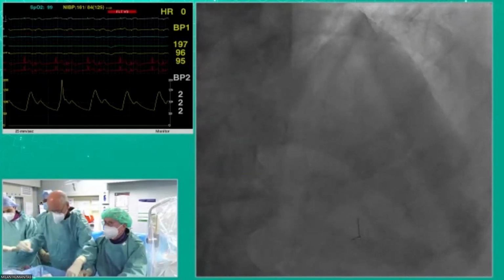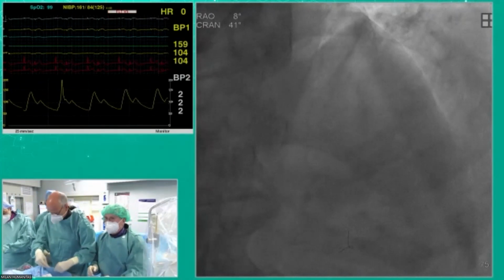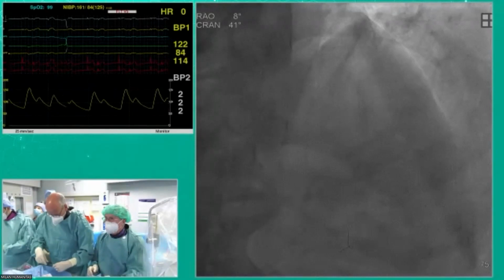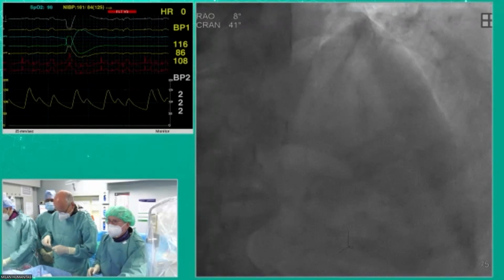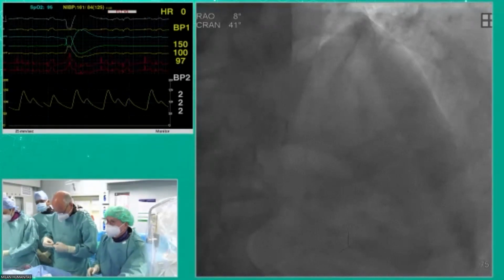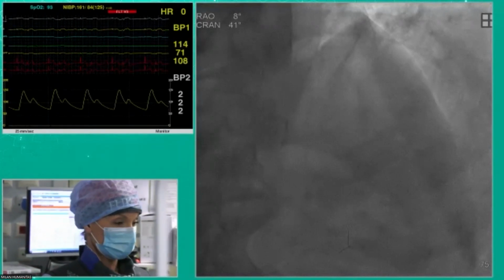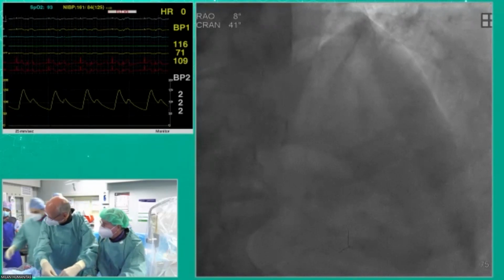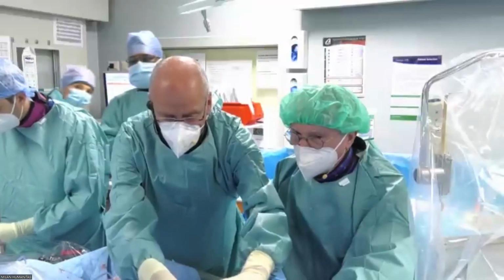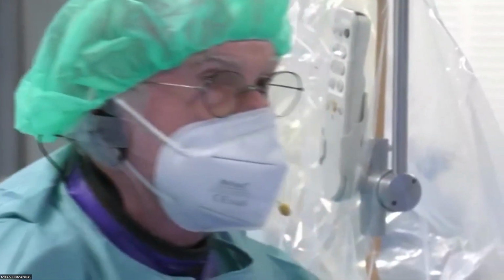I wanted to place a stent proximal, but you know, the result is not so bad. We dilated. We certainly need to dilate proximally with a Trio, non-compliant. Maybe we need to do more dilatation where we did rotablation. But remember, we are not doing cosmetic surgery of the coronaries. We are trying to establish a good distal flow in a patient who is asymptomatic. So our goal is not to make it symptomatic.